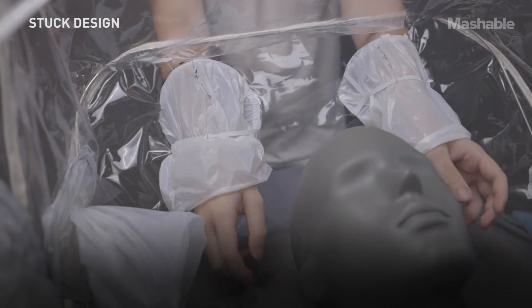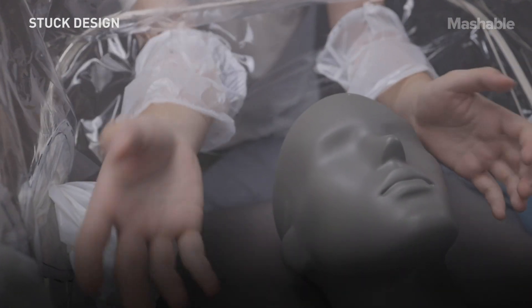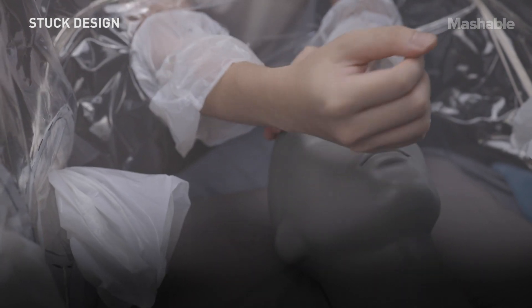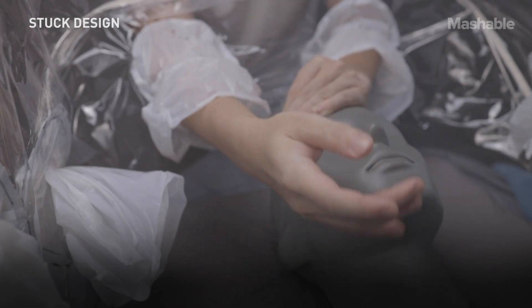What we have done here allows the surgeon to wear the most comfortable gloves that he wants to. It's not something whereby the glove is stuck onto the system and you put your hand in and out of that glove — you're actually wearing the glove that you would like to wear.